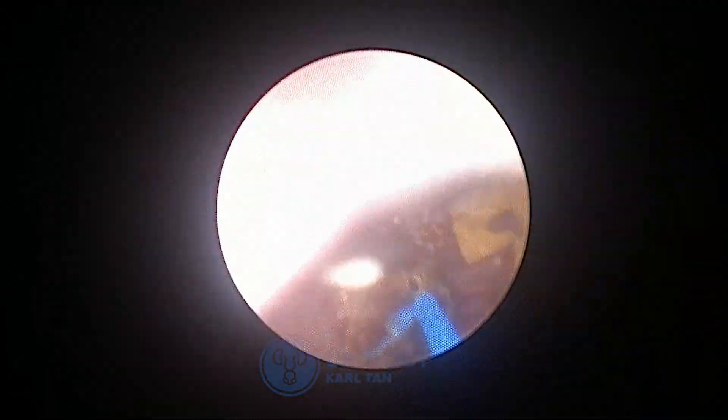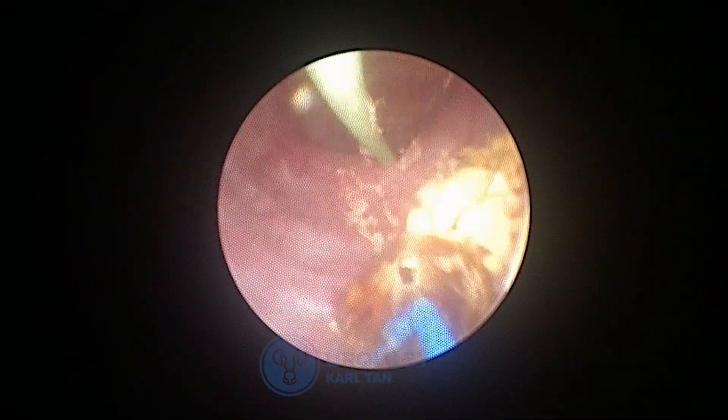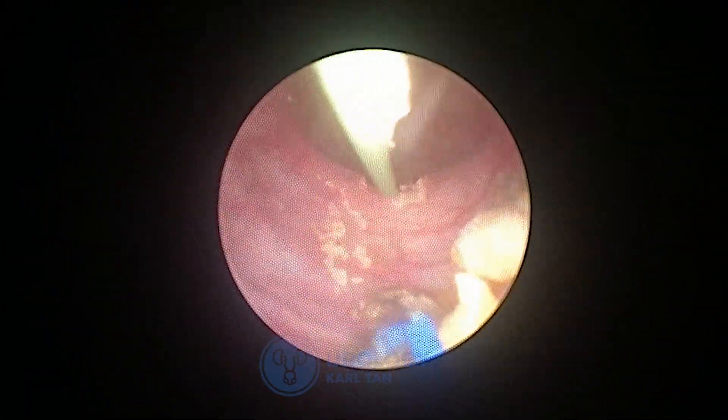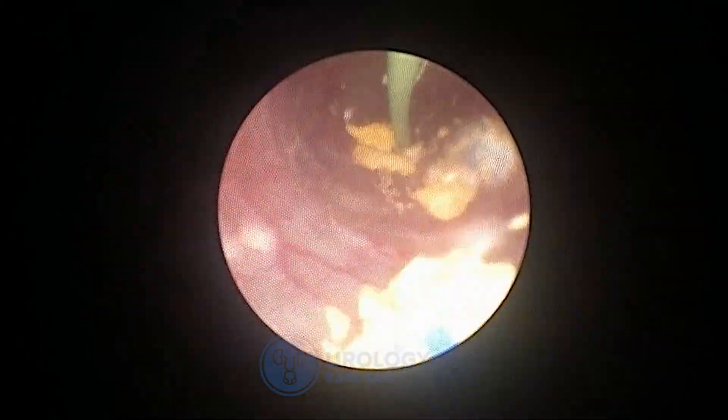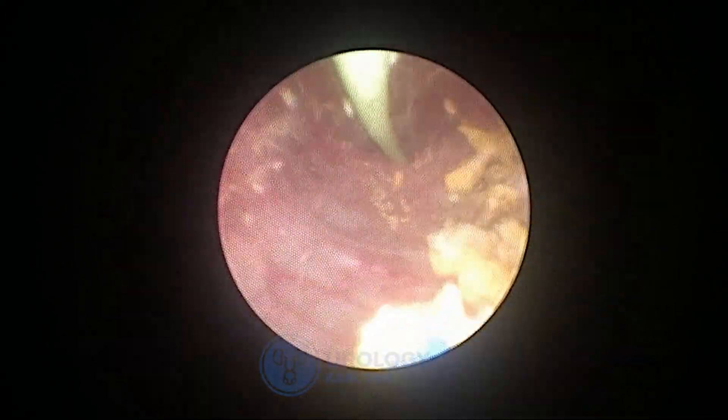Later on, we will see the stone turn to dust, and we will be able to clear out the ureteral orifice. We can keep the dust inside and let the urine push the very small microliths out.